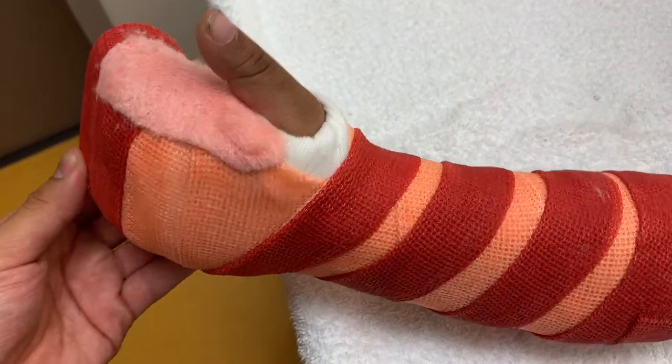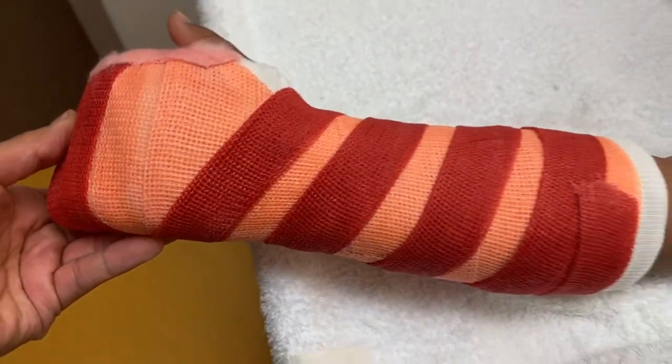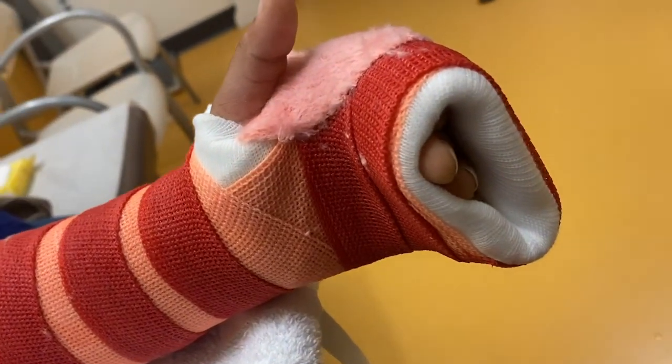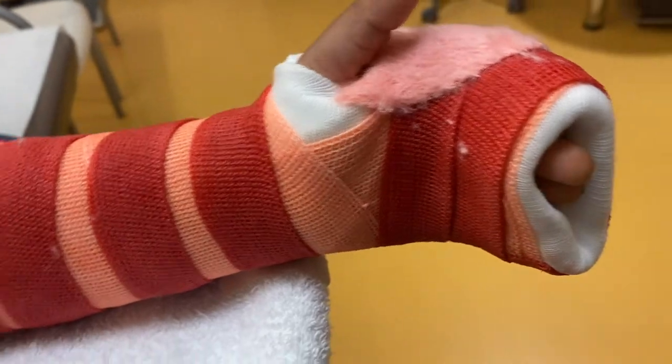Here is a brand new cast — it is still a cobra cast but in new colors. So much more bright, so much more clean, and it just looks more beautiful. But of course, when this patient comes back in a couple of weeks, it will be dirty.